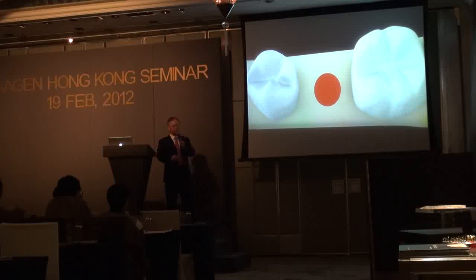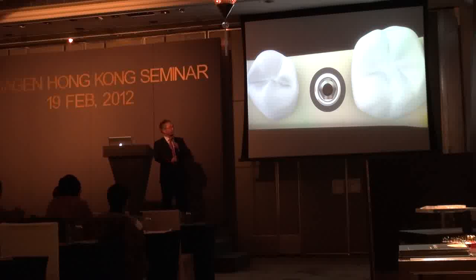But for the strength of the implants to withstand the occlusal force, we try to place wide implants, right? But if we place wide implants, we have only a limited amount of buccal and lingual bone. It can reduce the vertical height. It can make bone loss around the implants.